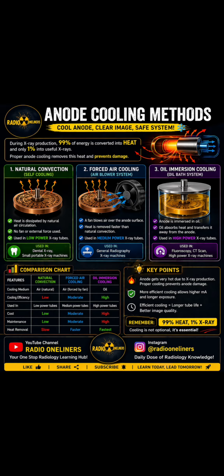Next we have another very efficient method, the oil immersion cooling or oil bath system. How does it work? Here the anode is immersed in oil, as the name suggests. The oil absorbs the heat and carries it away through the molybdenum stem that we have already studied.